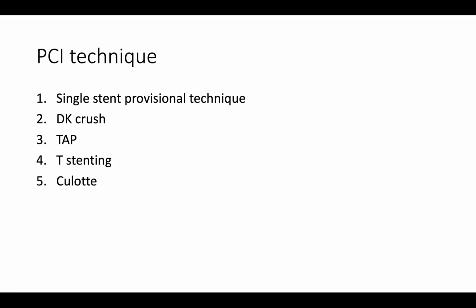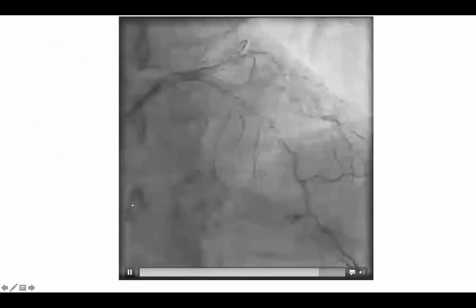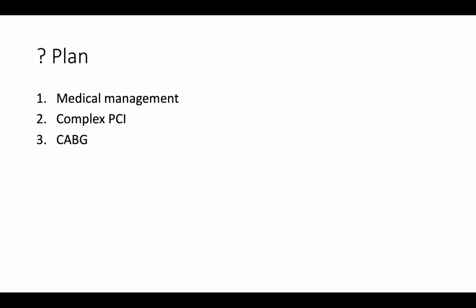I think there is another. I think the distal LAD is diffusely diseased. And yeah, distal LAD has diffuse disease, but we can see that. Yeah, this is the area where it's mid LAD actually. Technically, this is having severe disease, and then we can see the other images. The ostial LAD has disease, which is coming from the left mainstem. Yeah, I mean, where the surgeon has to put a graft, I think that's quite a significant disease segment. So surgeon will not take this case. I know they will run away from this case.